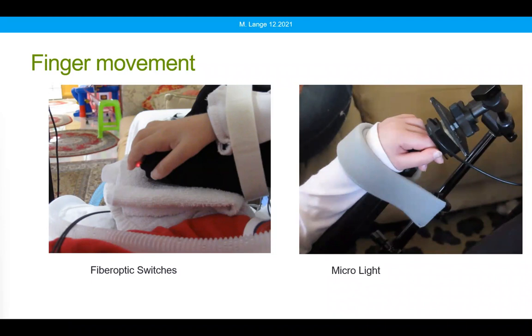That red light that you see there is only visible really on the camera, but that's that fiber optic light. Usually we wouldn't see that. He's actually sitting in front of the switch with that finger about quarter inch, and then he pulls back slightly to activate it.